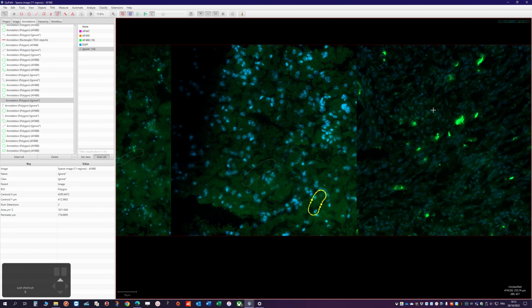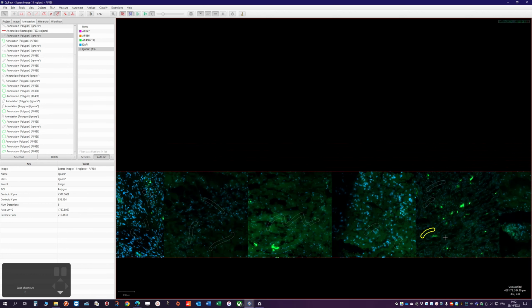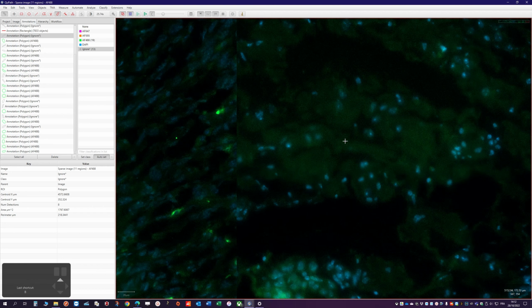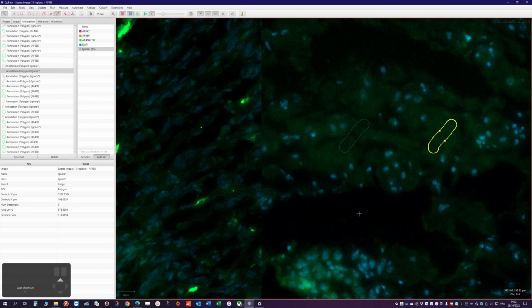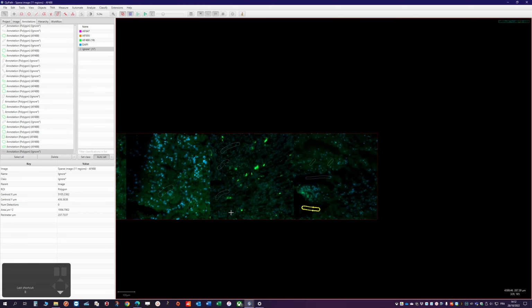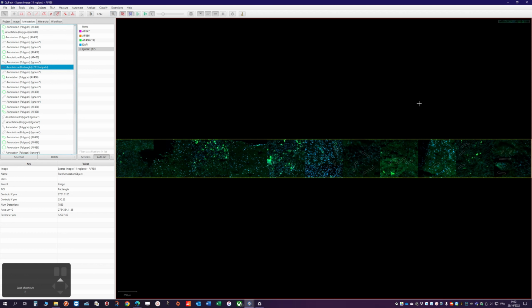That's why this sparse image is so useful for the training, because otherwise you will probably stick in the region you consider interesting for you and avoid the regions that are not. But the problem is that you will probably create a model that is not robust enough. So I think this is enough. Let me just zoom back here, and let's find our square region here, and let's try to see now the classification with the cells enabled.